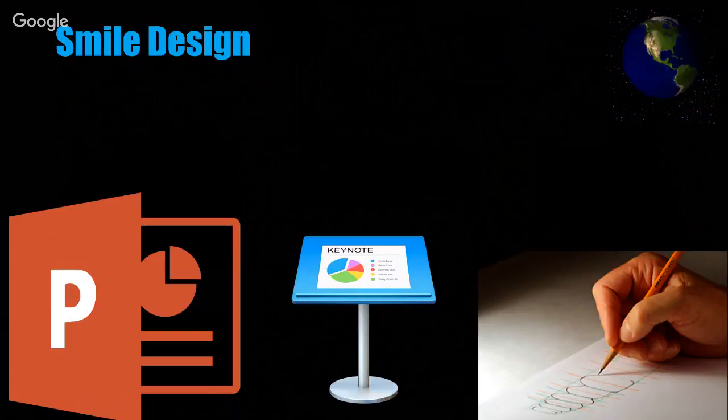as well as your execution of this smile design plan and the ratios and measurements which you get in the end. That's what you care about. If you know how much your central incisor should be in length and width, and you have those measurements, you can transfer those marks to the dental technician and he will perform his work.